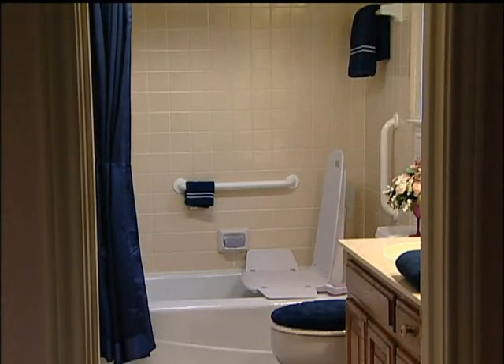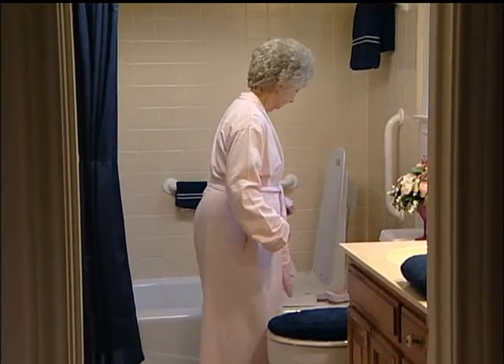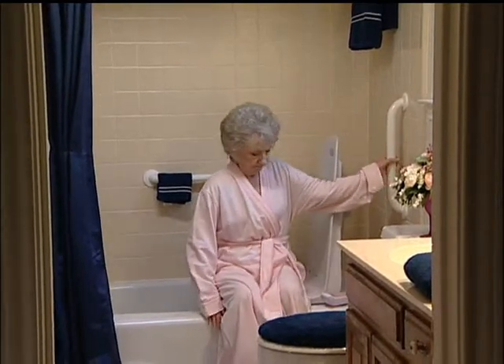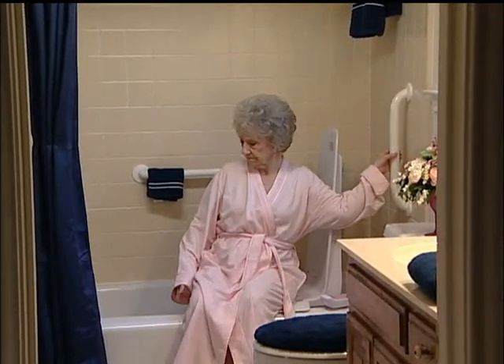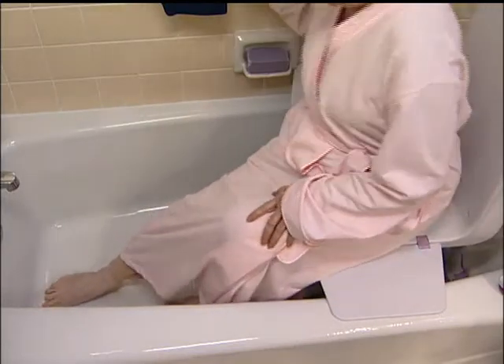The following video shows a brief demonstration on the use of the Archimedes bath lift. The Archimedes fits attractively in your bathtub. The lift should be raised to a position where the transfer flap rests on the edge of the tub. Please note that grab bars are recommended for use with any bath lift. Get on the Archimedes by sitting on the transfer flap and sliding over to the seat section.